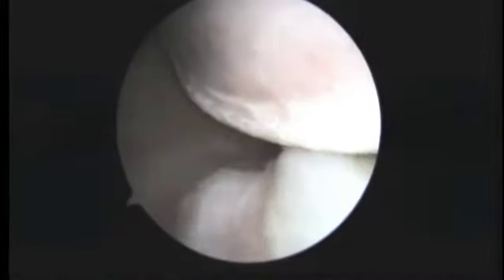As we look at the posterior labrum, that actually looks okay there. So we're going to go off on the video for just a minute.